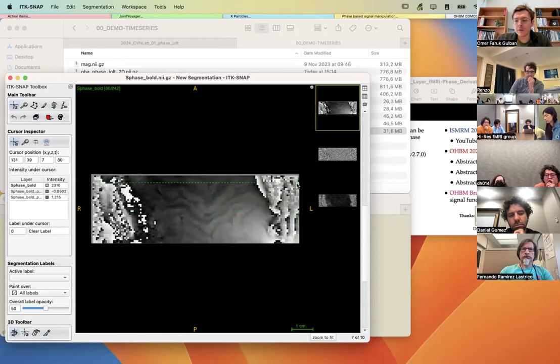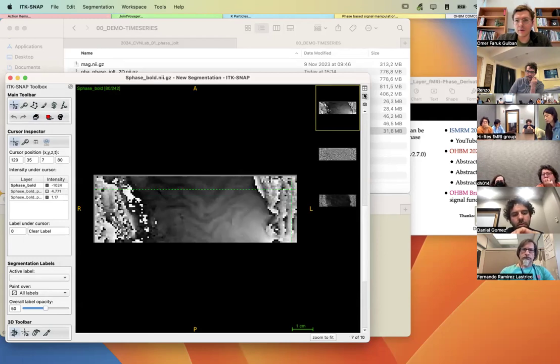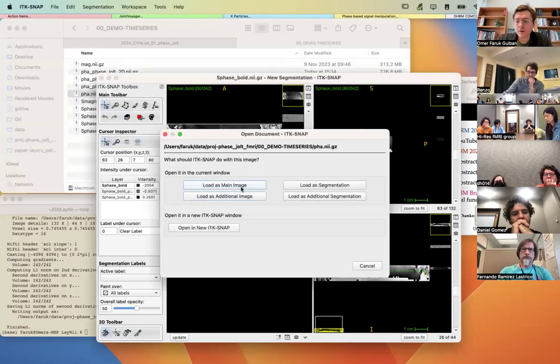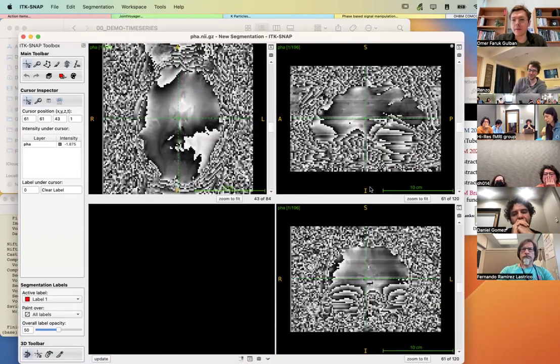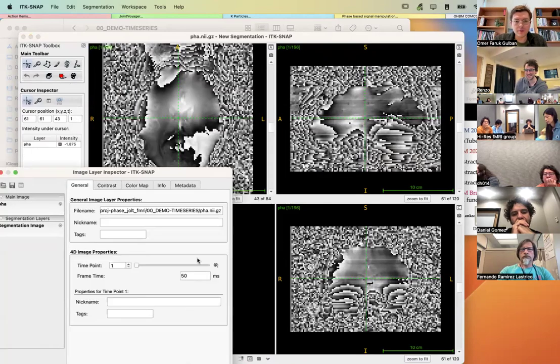Whereas outside, are we seeing the equivalent of a baseline change? Or do you not have that, like a phase baseline? What do you mean baseline? Well, you have EPI data, often the baseline might move a little bit, and you detrend it. Oh yeah, you see this wave effect that is washing over. I think that's maybe just the oil heating up or something. Maybe Renzo understands that artifact better. We have a global phase correction at the beginning of the scan, so there's no frequency updating. Yes, there's a frequency increase over the scan.